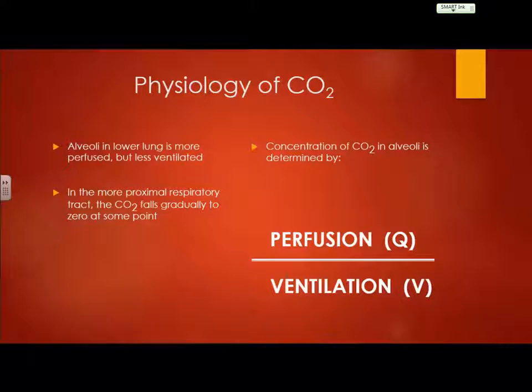The concentration of CO2 in the alveoli is determined by perfusion and ventilation. Where have we heard this before? VQ mismatch. Ventilation-perfusion mismatch, all right? In order for CO2 to be what it needs to be, we need to have good ventilation, and then we need to have good perfusion. Now, we've talked about the VQ mismatch. This will give us a little bit better of an indication of maybe what's going on in some aspects, all right?